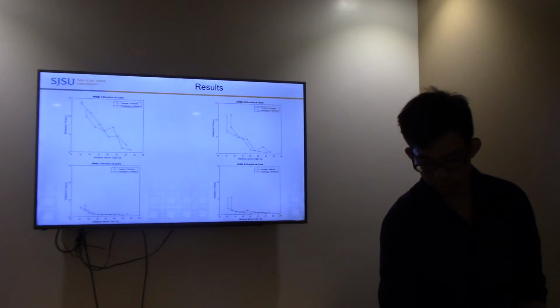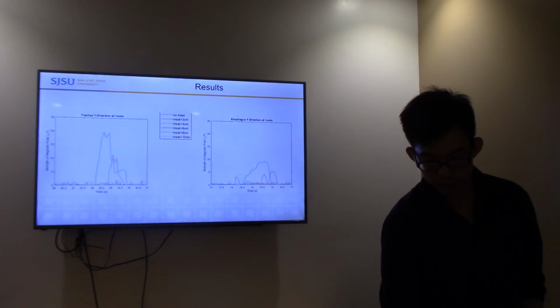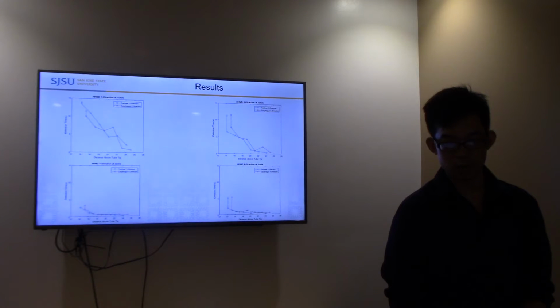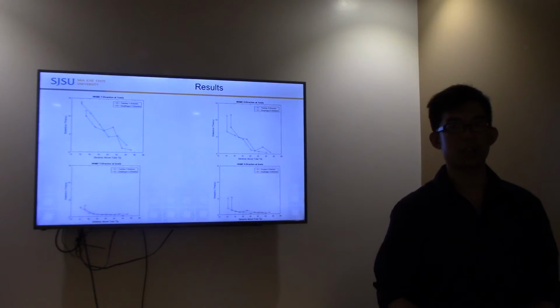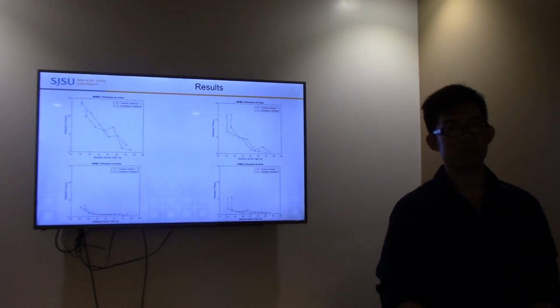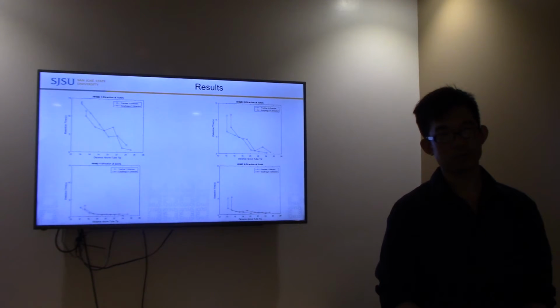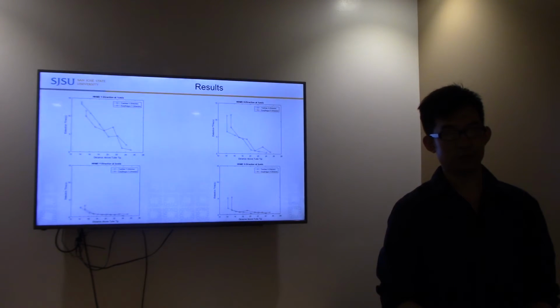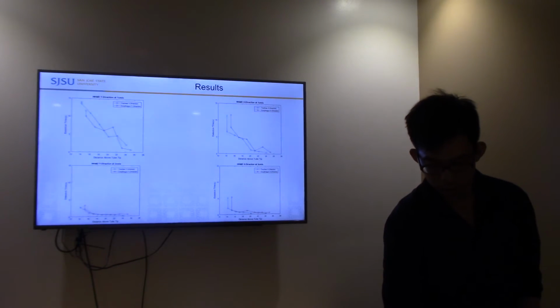Oh yeah, it does matter. I don't have the graph for that, but a slower speed provides a higher detection time than a faster speed. Well, it makes sense though, right? Yeah, because it's passing through the zone slower. Right, but if you normalize it, if you got a distance out of it, what do you get? Isn't that what you want? You want to be able to measure the length of your tube or the distance of your tube?